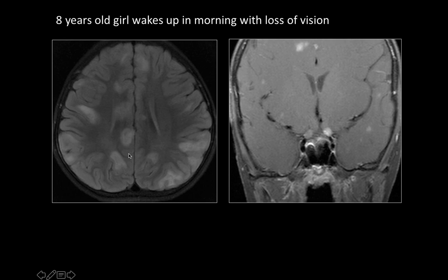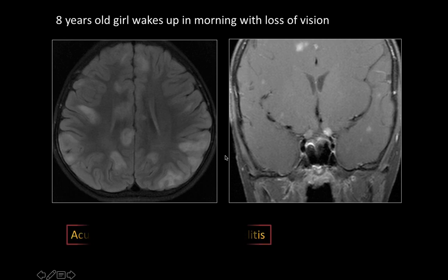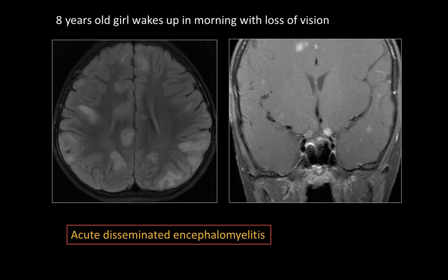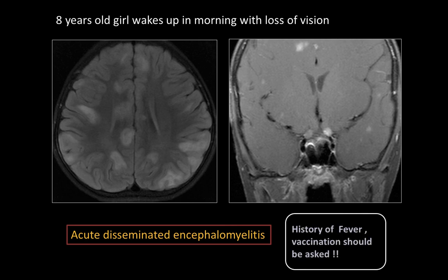This is an 8-year-old girl who woke up with acute onset of loss of vision. On FLAIR axial imaging we see multiple cortical, juxtacortical, and deep white matter lesions which are very large, along with enhancement of the optic chiasm — optic neuritis associated with these brain lesions. This is acute disseminated encephalomyelitis or ADEM. The patient had a history of fever and vaccination a few days prior, making that history extremely important.